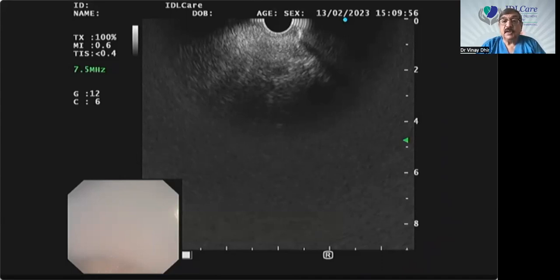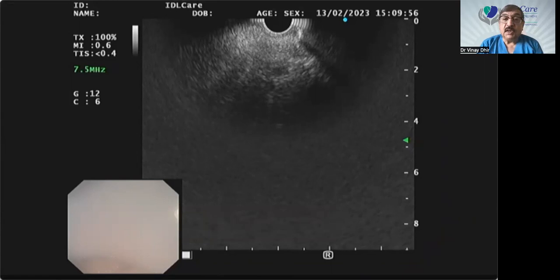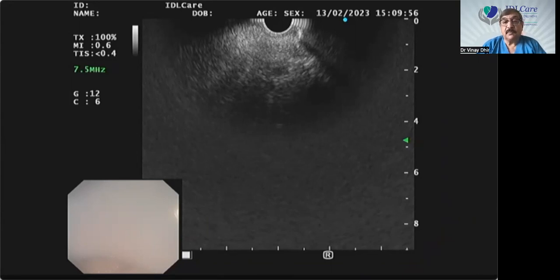Today we will go still further and discuss how to see the AP window. There have been many methods described in the existing literature and all those methods are very good. But the method that we use is a very simple method that causes little or no inconvenience to the patient, while the methods that are traditionally used require the echo endoscope to literally hook up, which sometimes causes patients discomfort and cough. We will also look at the lymph nodes in the neck and the upper mediastinum.